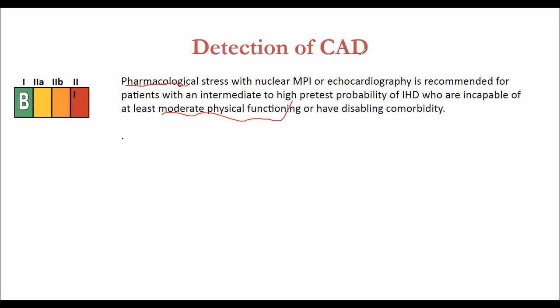So when you are going to prescribe, ask patients how much they can walk, whether they can brisk walk or not, before prescribing it as an exercise MPS. Otherwise you have to prescribe it with dipyridamole in our setup.